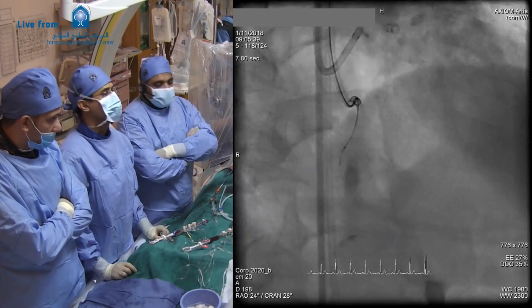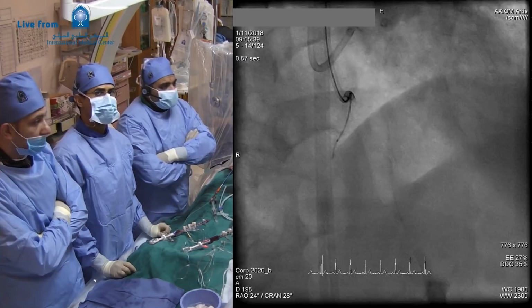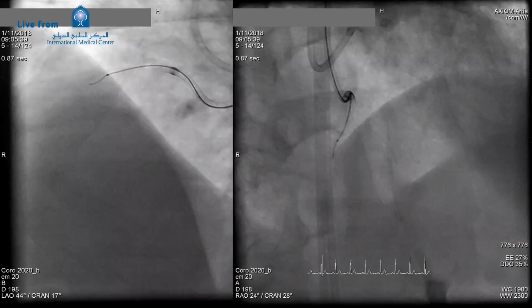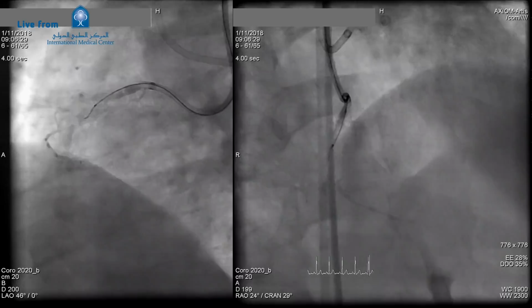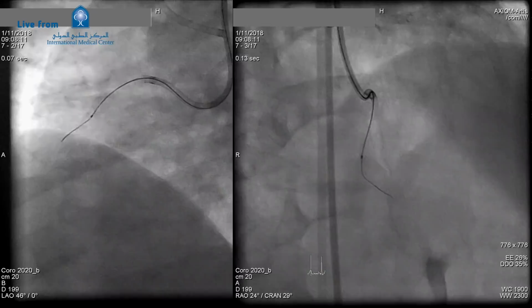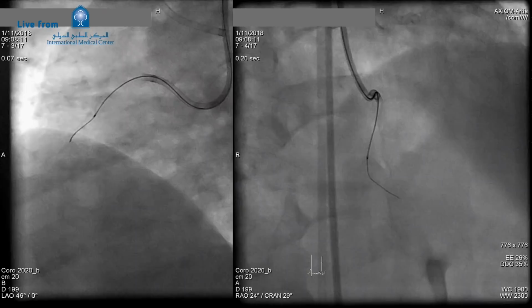Yes? Okay, so if you can see the other view, this is the lateral one or the LAO. Yeah, can we put the biplane, please? If you can see the biplane. So as you see here, both views show that we are in the true lumen so far. Next. Then making sure that we are in the channel. There is maybe a branch just at the tip of the wire in the AP cranial view. Next. So the wire went to that branch. So now we are sure we are in true lumen. Here is where we are right now, and Khalid is trying to negotiate the wire directed toward the RCA.